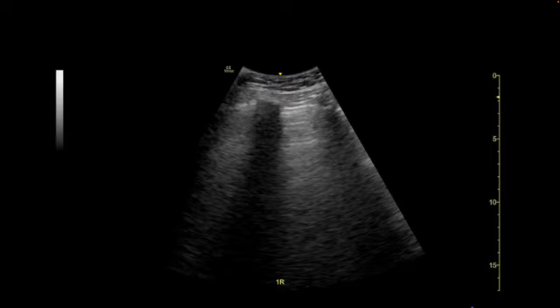Now, in the previous lung video, Dr. Daniel Embaum explained why each of them is beneficial when looking at the lungs. Remember, when you click your lung preset, that is going to show all the artifacts, particularly in a wet lung. When you click the abdominal preset and look at the lungs, that's going to hide those artifacts more, but it's going to smooth out your assessment of other structures. So when you're starting out, you should practice using both presets. So here right now, we are on the abdominal preset.